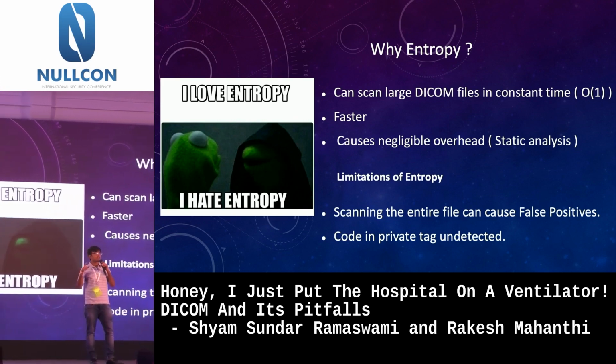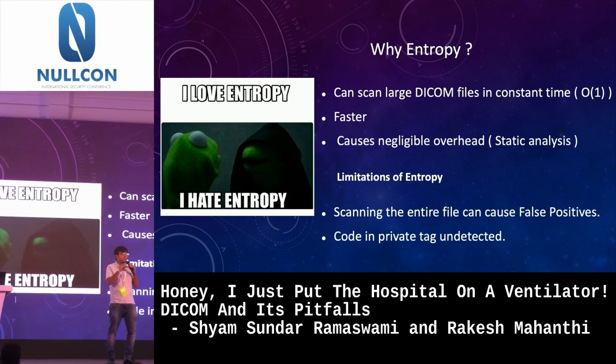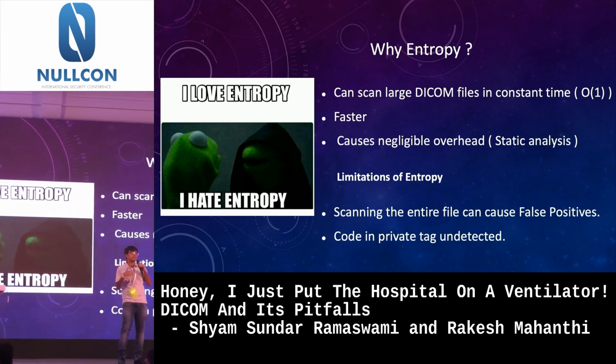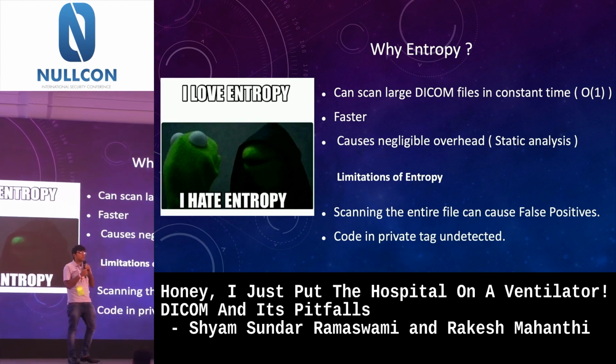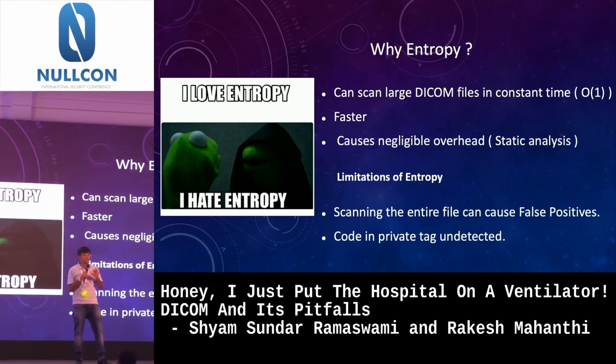We've improved that and we've decided to look only at certain sections of the DICOM file, the DICOM preamble. That has been filed for a patent with the company, which I can't reveal, but I'll tell you there are certain limitations to the technique of using entropy as well.